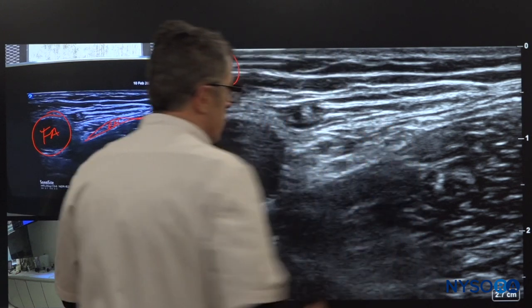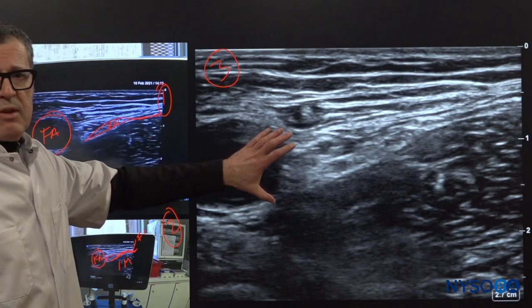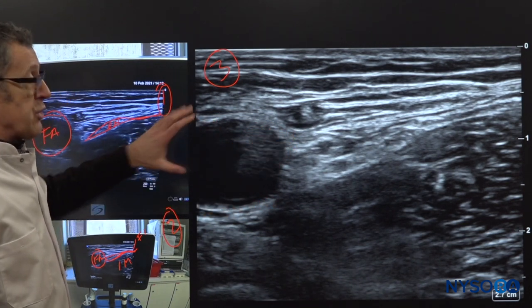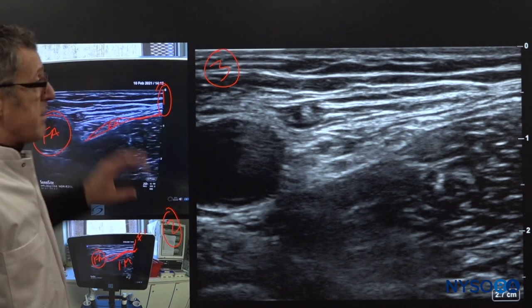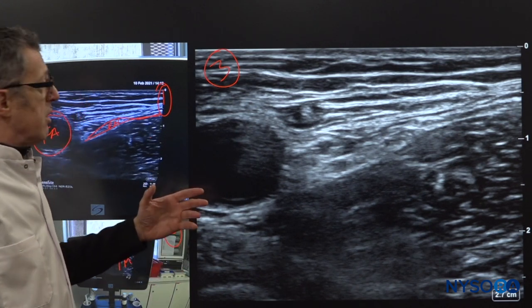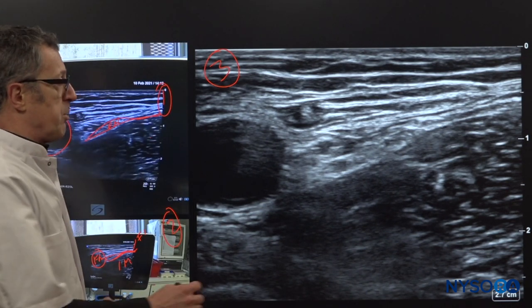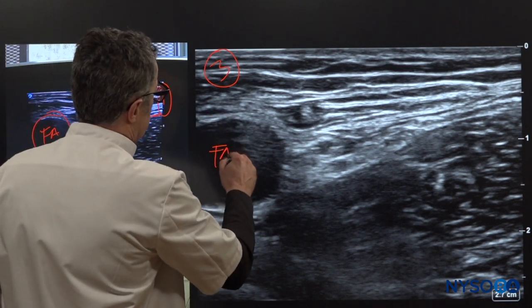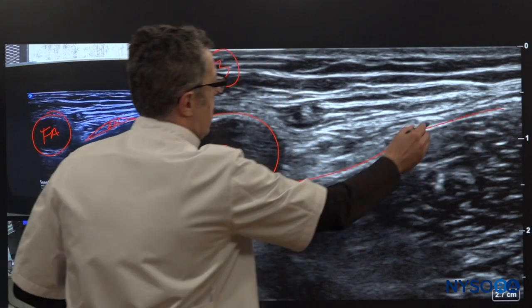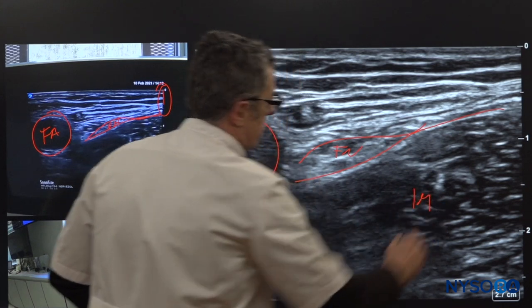When I move to the large image, it's supposed to be a lot better, but my mind starts to get lost in the maze of information. The image is simply very large, and it takes some time to get adjusted to it. When we're already primed with the small images it might be a little easier, but imagine if you only had this image without a prior reference — it would be a lot more difficult to pick up the anatomical information. So that is the femoral artery, that is the fascia iliaca, that's the femoral nerve between the two layers of the fascia iliaca, and that's the iliacus muscle.